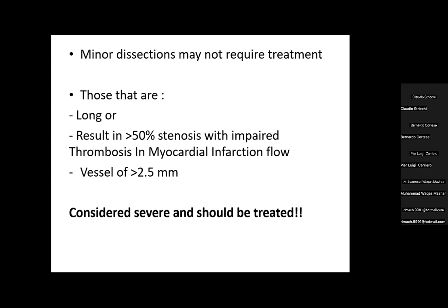And you usually treat the anastomosis or the original vessel, the LAD, without looking at the RIMA or the LIMA engaging the artery. You always forget about it. So when you do the final shot, you should analyze and assess very clearly if you have created a dissection there. This is a useful tool, but if you don't send patients to the cardiac surgeon, you don't have this issue.